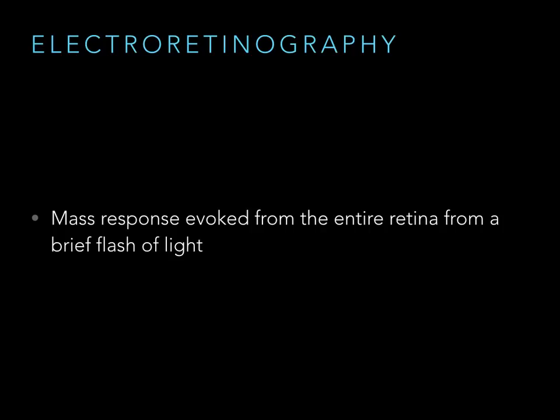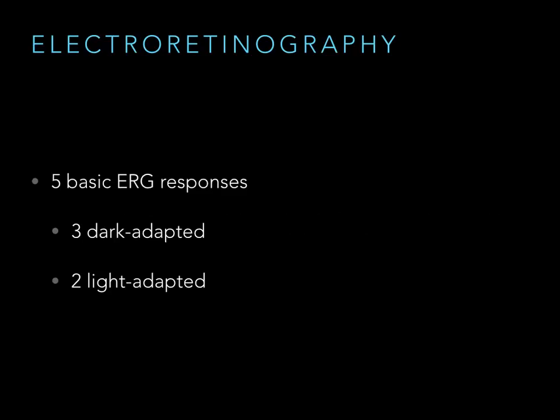This, again, is a poorly understood, I think, way of testing the retina. And again, it's probably because we have other ways of doing things that are more non-invasive and quicker. Mass response from the whole retina, we also call it Ganzfeld or full field ERG, and it's a brief flash of light. The way to think about ERG is there's 5 of them.